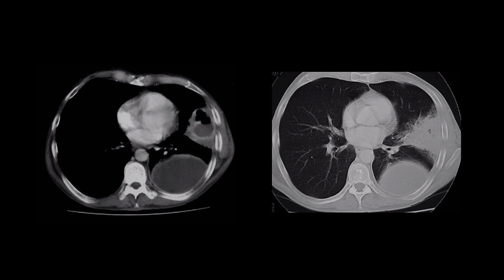One final tip is that CT can help differentiate between a loculated empyema and a lung abscess, which are both opacities filled with fluid or with an air-fluid level. They differ in two ways: wall thickness and mass effect. An empyema has uniform wall thickness, and an abscess has irregular wall thickness.